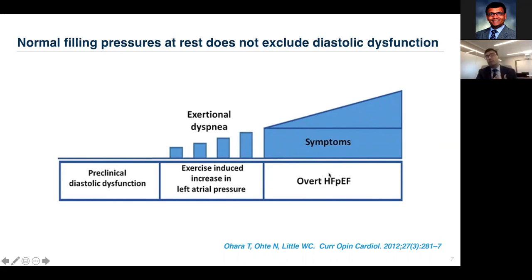And finally, there are patients who have overt heart failure where features of elevated filling pressures are present even at rest. So this may happen across the continuum, and exercise can be used as a potential method to uncover the presence of underlying diastolic dysfunction and elevated filling pressure, particularly with exertion.